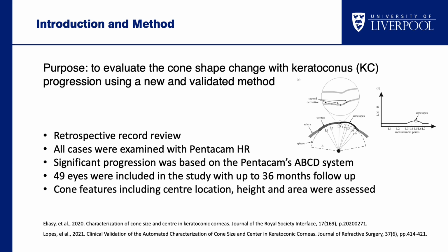In the current study, which was a retrospective record review, all cases were examined with Pentacam HR. Significant progression was based on Pentacam ABCD system. 49 eyes were included in the study with up to 36 months follow-up. Cone features, including central location, height, and area, were assessed for all patients.